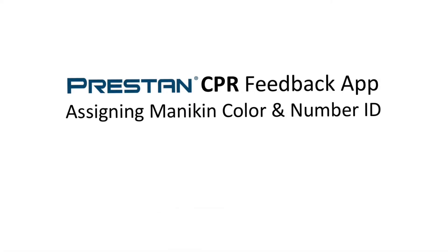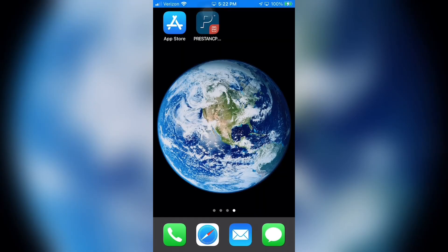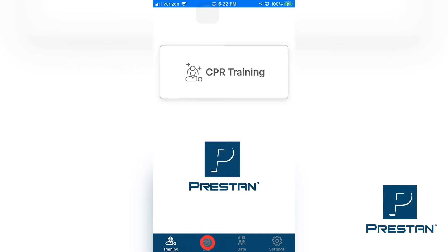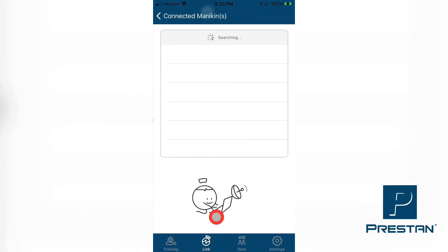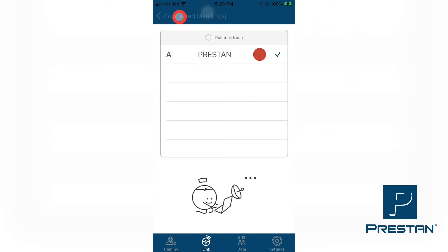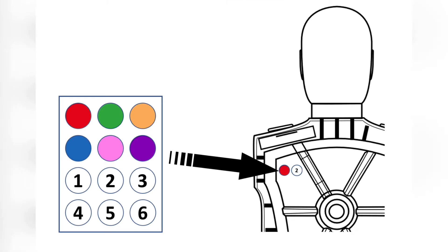Preston CPR Feedback App — Assigning Mannequin Color and Number ID. To assign your mannequin a color and number label for easy identification during training, select the Link tab found at the bottom of the Preston CPR Feedback screen. Select Search Mannequin. A list of connected mannequins will appear. Select the desired mannequin from the list, ensure that a checkmark appears next to the name of the selected mannequin. Select connected mannequins, and then select the chosen mannequin from the list. Tap the Change button in the row titled Color ID.